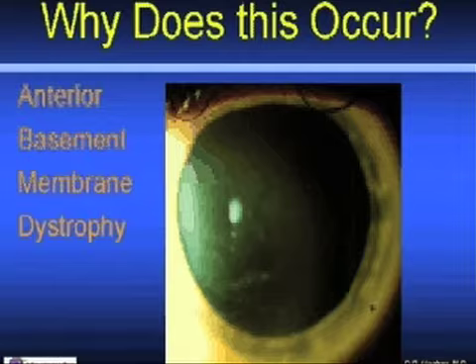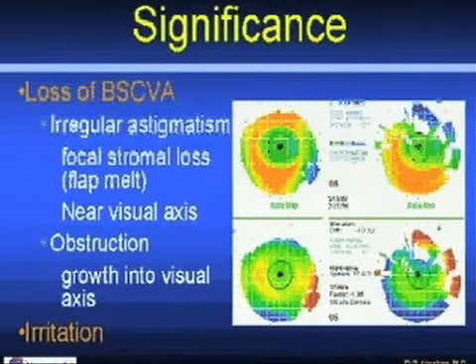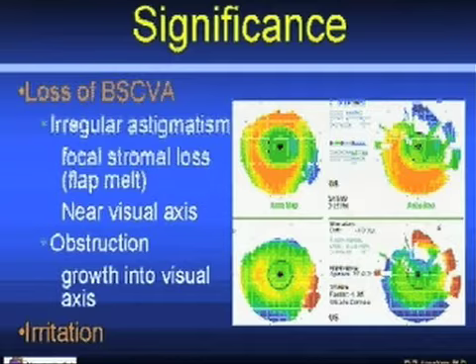When it occurs, oftentimes it's not even visually significant, just causing a small area of abnormal epithelium at the periphery and doesn't lead to progressive epithelial ingrowth requiring removal. But in some patients it does go on to distort the topography and therefore the vision, and it's at this stage that it requires removal.